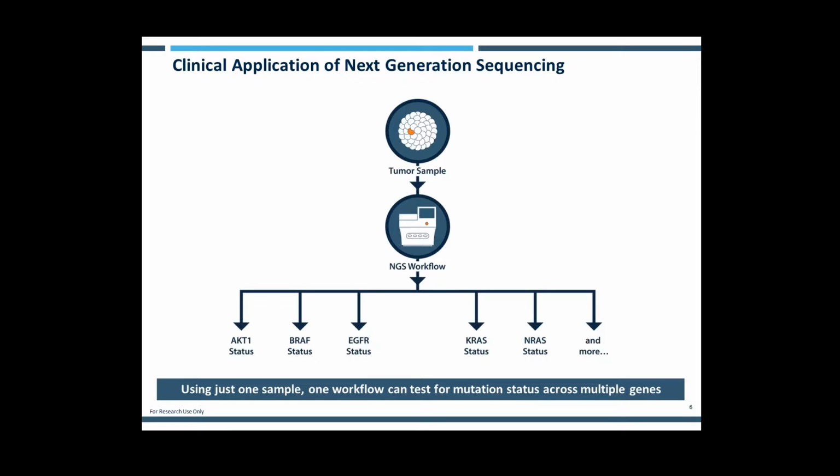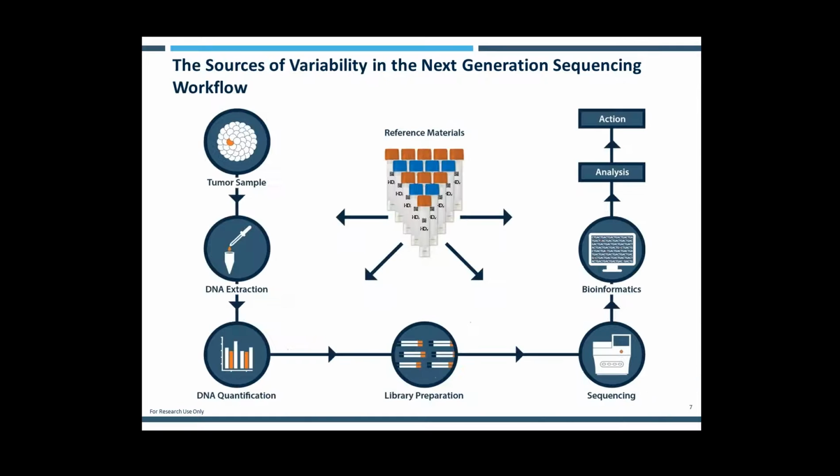And certainly in molecular diagnostic assays, where this could be going is in the cell-free DNA space, where you may have very limited material from blood to run such assays, or likewise if you're doing fine needle aspiration, the quantity of the sample is going to be very precious to you. So being able to apply a workflow that can give you lots of information all in one go is a very attractive proposition.